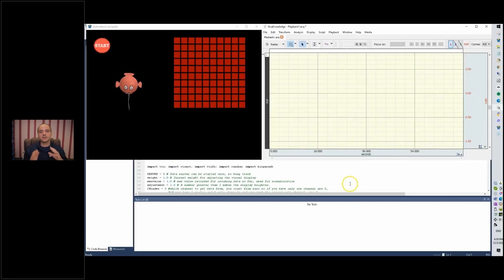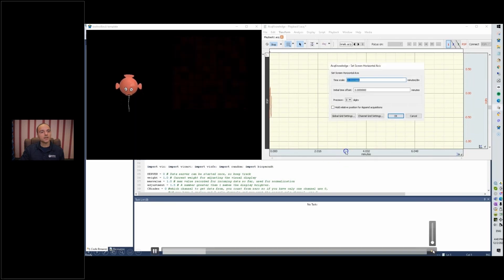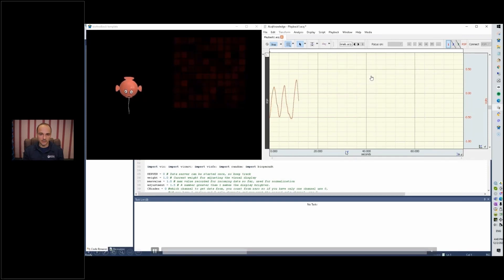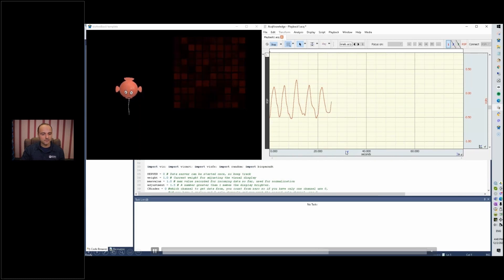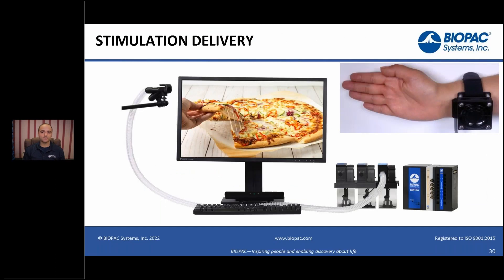We can stream physiological data into the virtual world. Here is an example: on the left side we can see the virtual reality display changing as a function of data in the system — that's respiration data. When we are inspiring it becomes blue, when we expire it becomes red, and the balloon moves up and down. It's just to give you an idea of how it works, but you can extend this to all sorts of biofeedback.